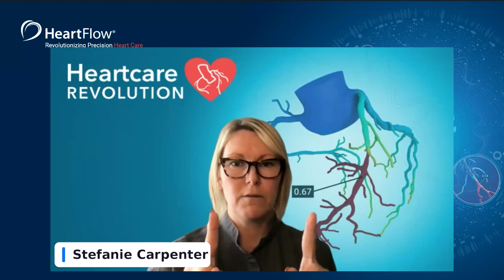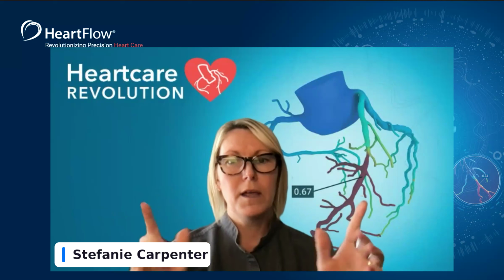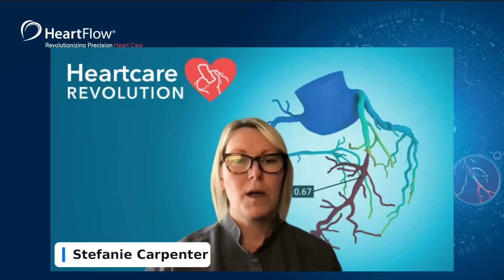And the slower the heart rate gets, the farther those peaks get apart, and the more quiet time you have. So you have more opportunity for less motion during those quiet times. And motion is kind of the number one barrier that we have when we're scanning coronary arteries, because we're scanning something that's really, really tiny and it's moving pretty quickly. So lowering the heart rate, again, is going to move your R peaks farther apart. It's going to provide more quiet time and less motion on your images.